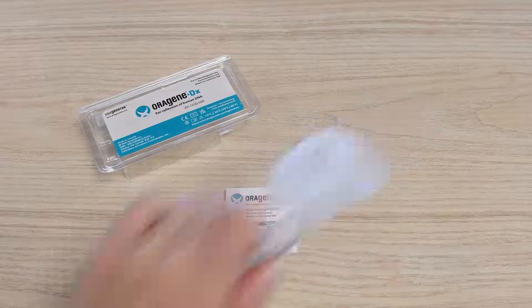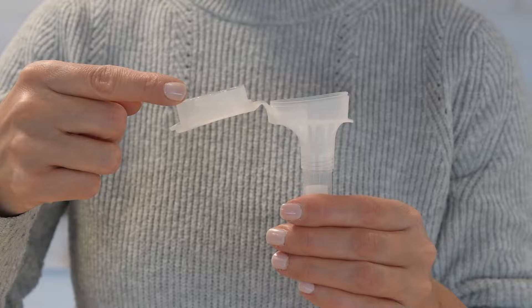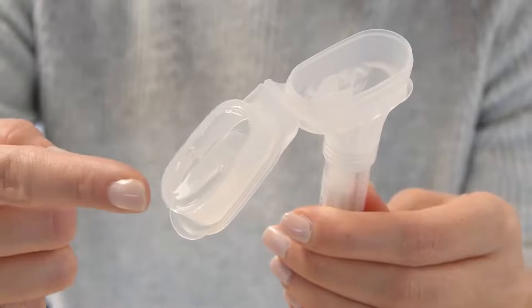The funnel lid contains a clear solution that will be mixed with the saliva sample when the kit is closed. Do not remove the plastic film.